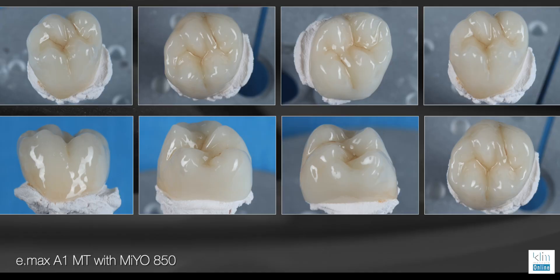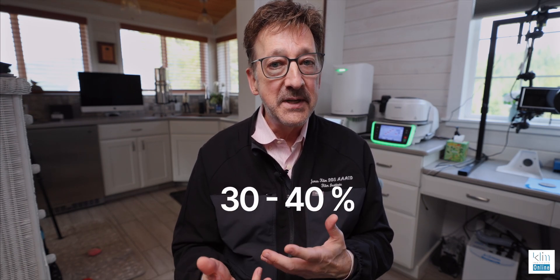So it saves me a lot of time clinically when I'm doing same-day dentistry. In fact, it's cut my time down to get the aesthetics I want probably by 30 to 40 percent when I'm doing the aesthetic cases chairside, and that's a big blessing for me clinically.